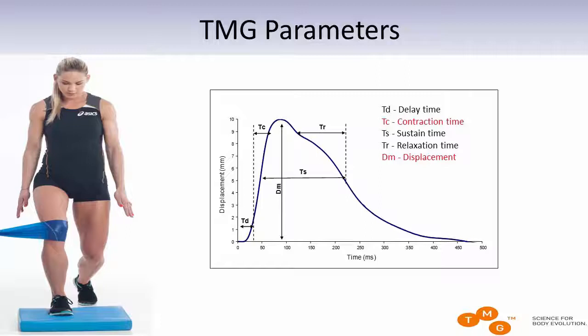But the amplitude usually is not measured and it's not determined. So I will quickly describe all 5 parameters, but I can tell you, of course, there are some researchers, they will disagree a little bit, but the fact is 2 of the parameters in all the publications in research so far proved to be more important than the other 3.